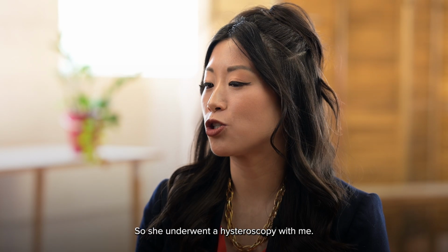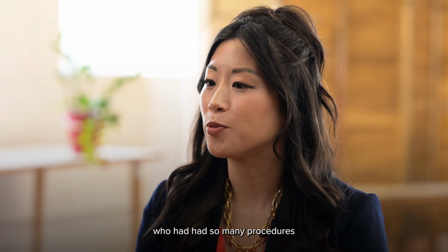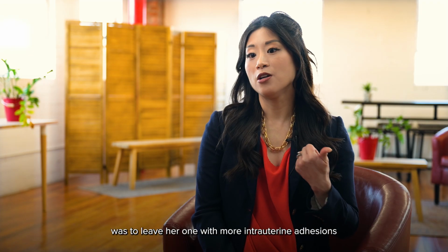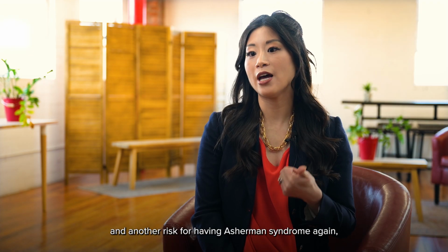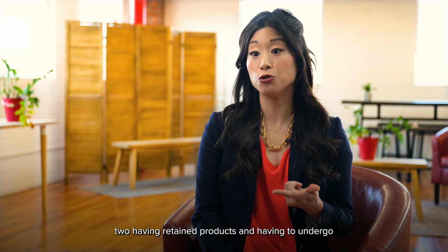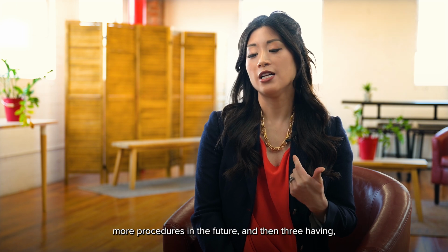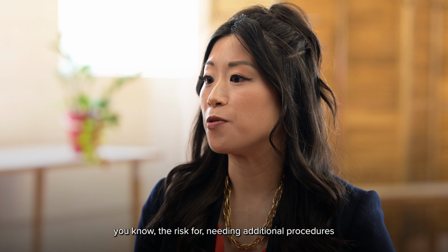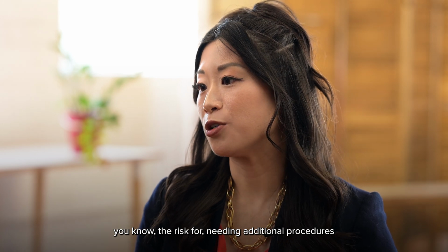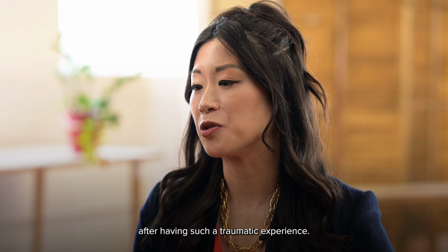So she underwent a hysteroscopy with me. The last thing I wanted to do to this patient who had had so many procedures was to leave her, one, with more intrauterine adhesions and another risk for having Asherman syndrome again. Two, having retained products and having to undergo more procedures in the future. And then three, having the risk for needing additional procedures and coming back again after having such a traumatic experience.